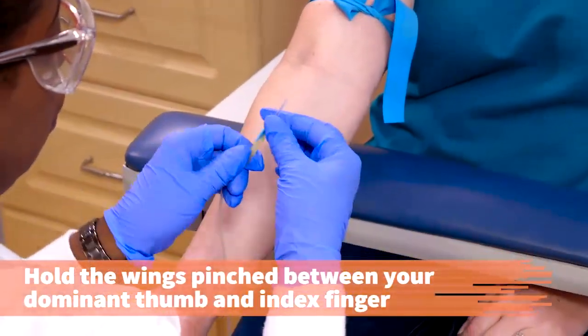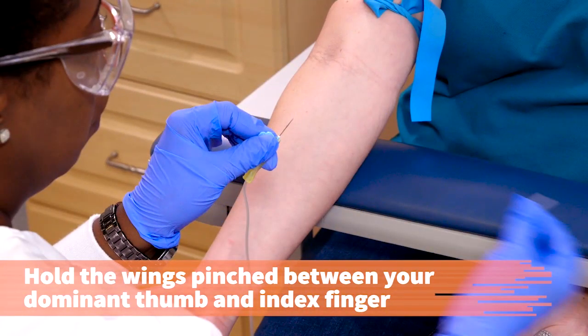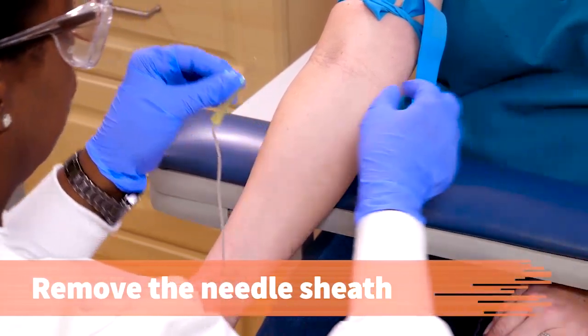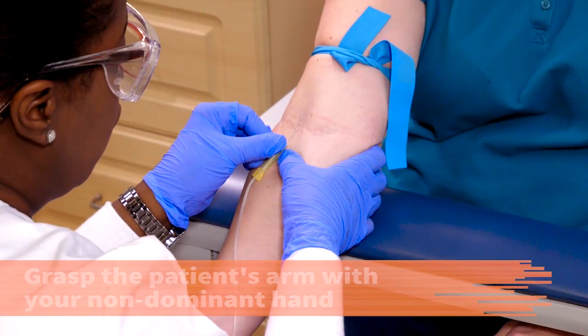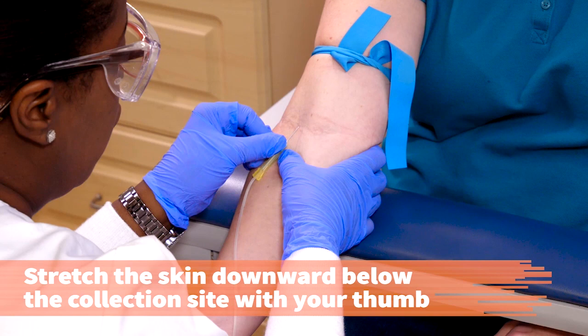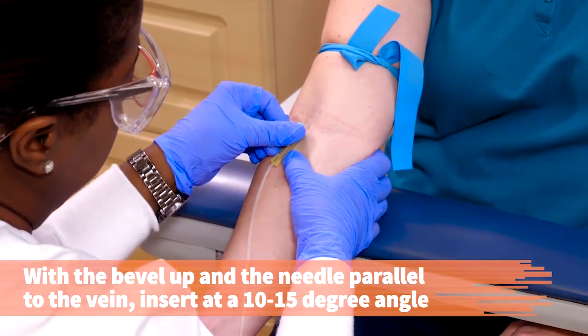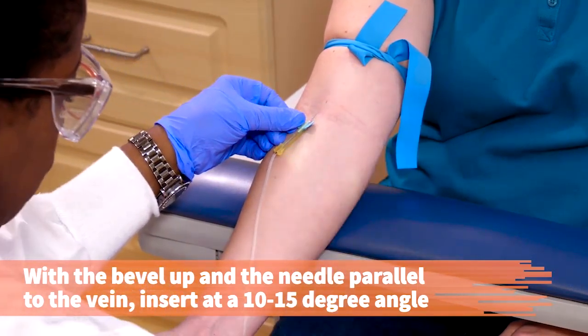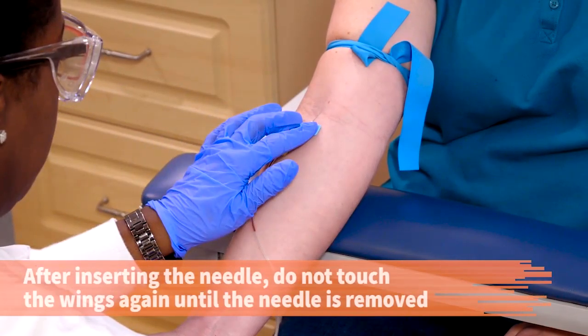Hold the butterfly wings pinched in between your dominant hand thumb and index finger, or hold the base of the needle. Remove the needle sheath. Grasp the patient's arm with your non-dominant hand and anchor the vein by stretching her skin downward below the collection site with the thumb of your non-dominant hand. With the bevel up and the needle aligned parallel to the vein, insert the needle at a 10 to 15 degree angle through the skin and into the vein with a quick but smooth motion. After inserting the needle, lay the wings flat against the skin and do not touch the wings again until the butterfly needle is removed.